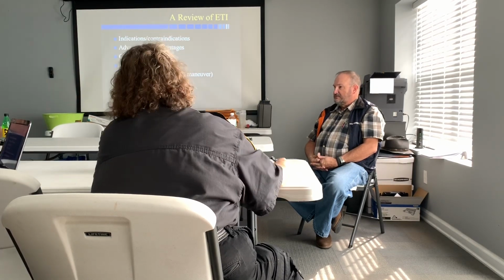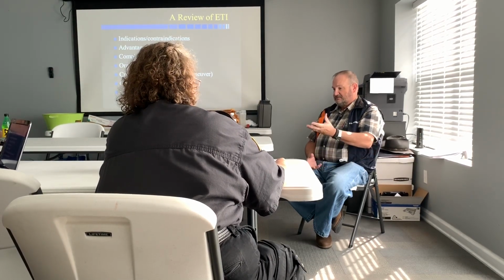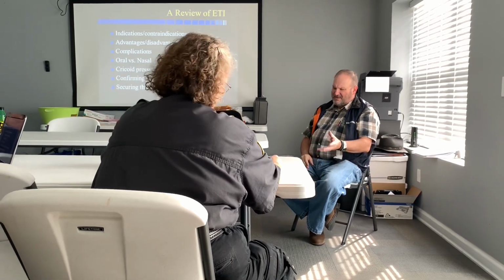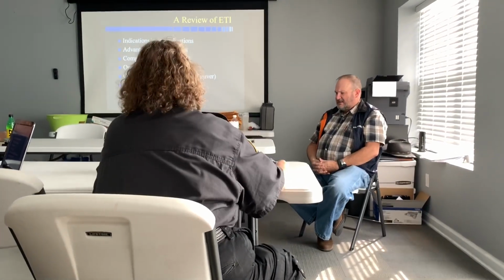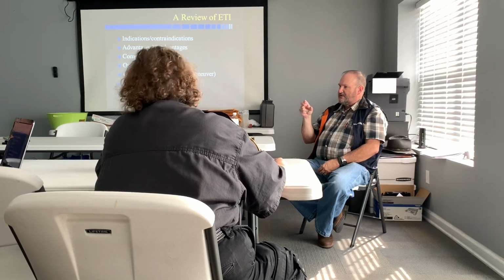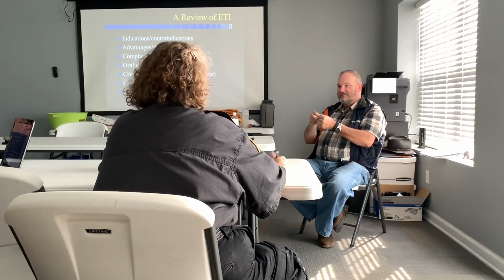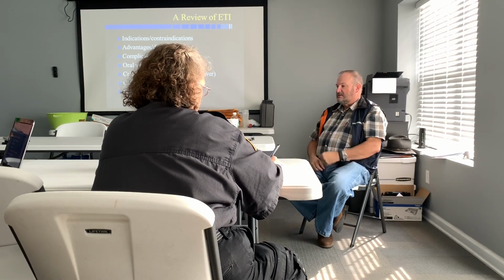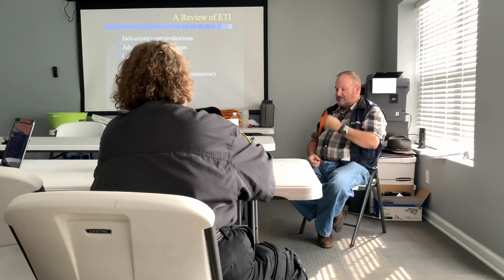Those of us in the field tend to use it, and tend to use it for the reason that it's there for. You'll hear, well, it's supposed to help open up the trachea so you can see it. That may be a secondary thing you might get out of it. But the primary reason for Sellick's maneuver is to push that semi-rigid trachea against the flaccid esophagus to keep him from throwing up, right? To keep him from throwing emesis into his lungs.